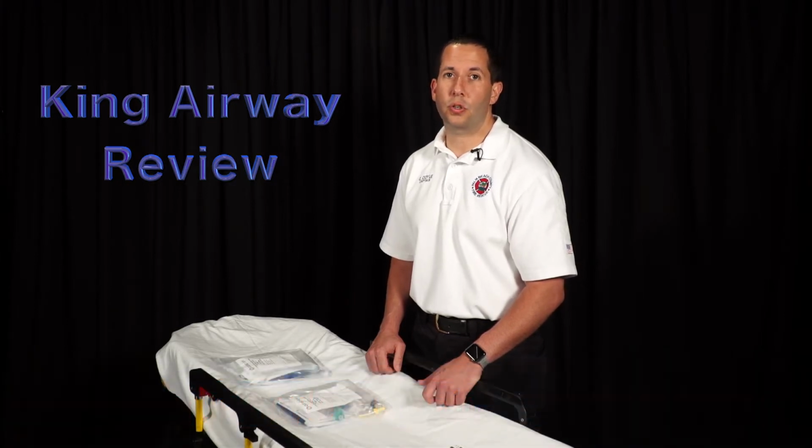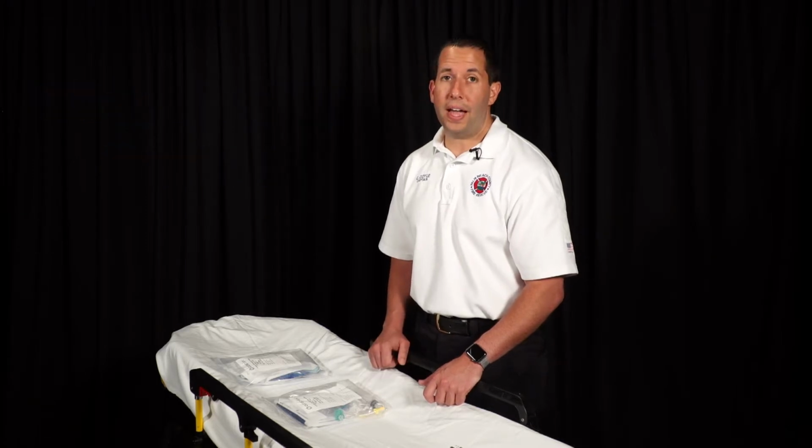Hi, I'm Charlie Coyle, and today's tricks of the trade are we're going to be reviewing the King Airway size 0 and size 1. It's a new piece of equipment we'll be putting on the trucks at Palm Beach County Fire Rescue for our pediatric cardiac arrest cases as well as our pediatric respiratory distress cases. I'm going to go ahead and open the bags, show you exactly what's in this bag, and teach you how to use it to make sure that you use it appropriately.